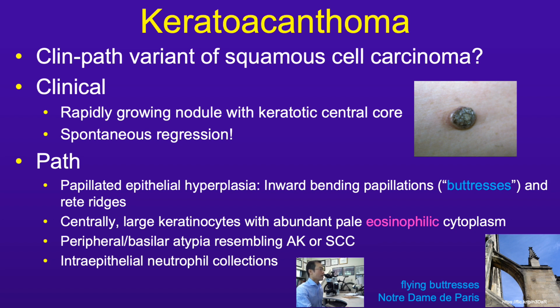And so as a pathologist looking at the slide, especially if it's a partial sampling, it may be difficult or impossible to tell whether it's a keratoacanthoma or not. And so from a practical point of view, it makes sense, especially off partial samplings. The other factor is that the diagnosis is somewhat of a clinical pathologic correlation, which is somewhat unique in the world of skin cancers.